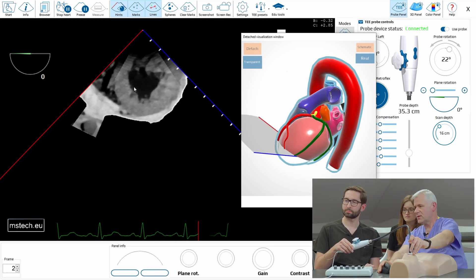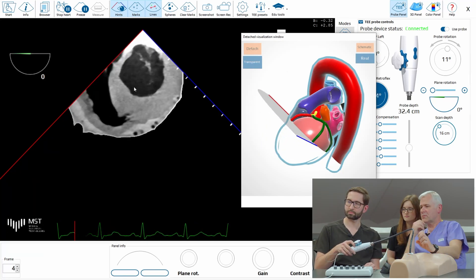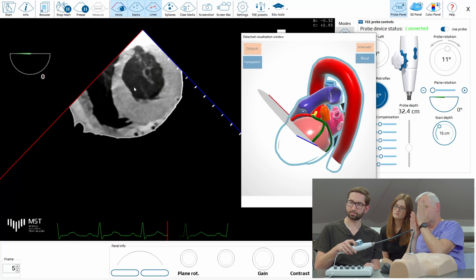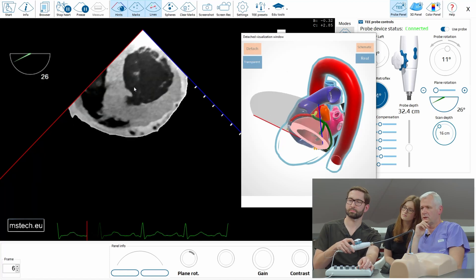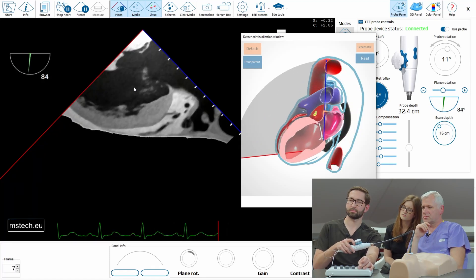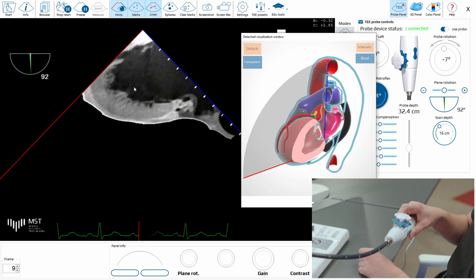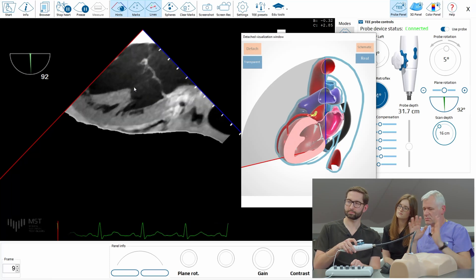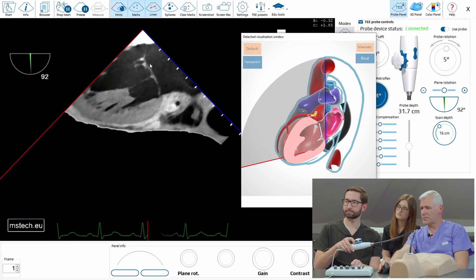When we are here at the level of the mitral, do the anti-flex and go to 90 degrees. We can use the 90-degree view to show the two-chamber view, which is the longitudinal section of the ventricle. This is the two-chamber view — not really the long axis view, which would contain the aorta — but here you can also see the left atrial appendage, the mitral valve, and the papillary muscles.